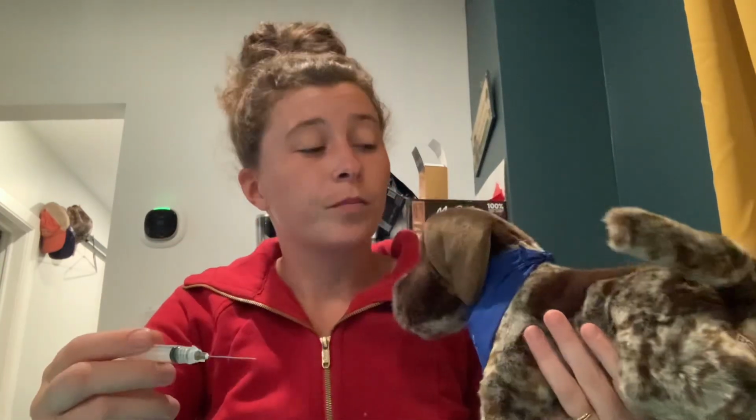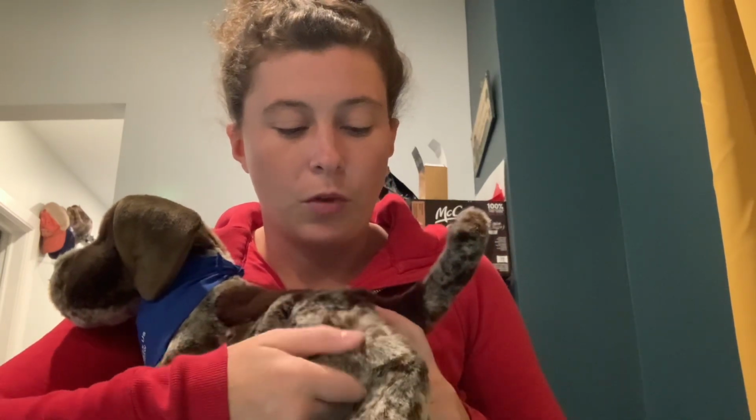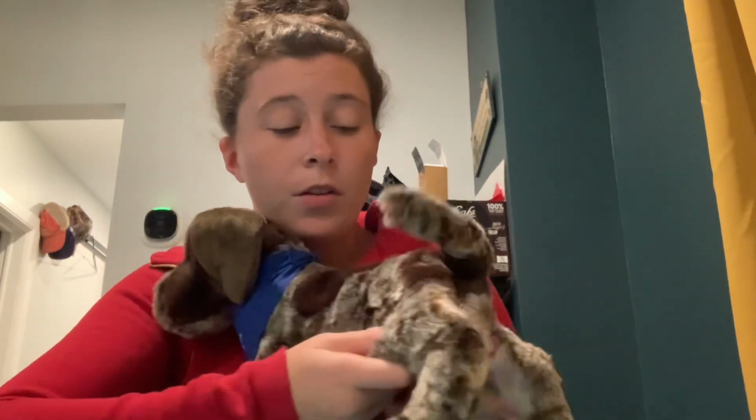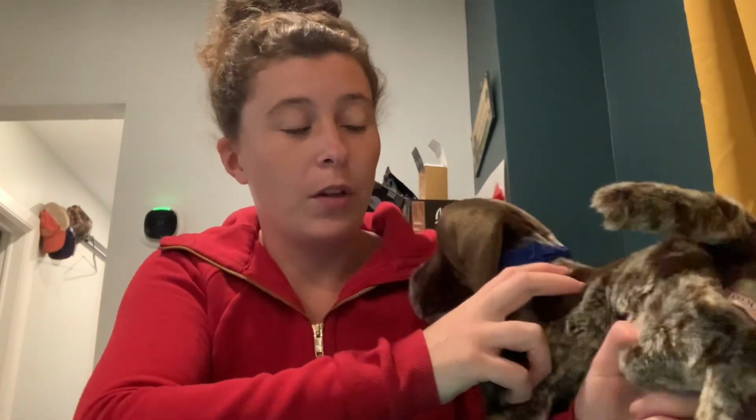We are all set. So I'm going to start here by looking for my muscle where I'm going to inject. I'm going to be doing the semimembranosus first. For the semimembranosus, I want to make sure that I'm feeling the femur. The sciatic nerve is going to run right alongside the femur there, so I want to make sure that I'm not going towards it. I want to make sure that I'm pressing in a caudal direction from the femur to isolate the semimembranosus. So I can feel it there.